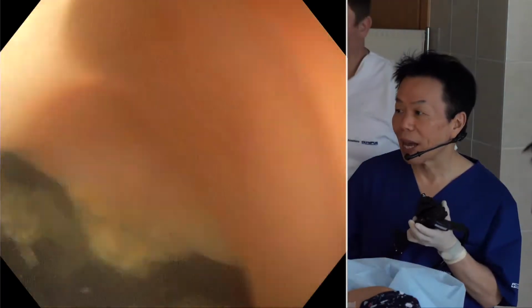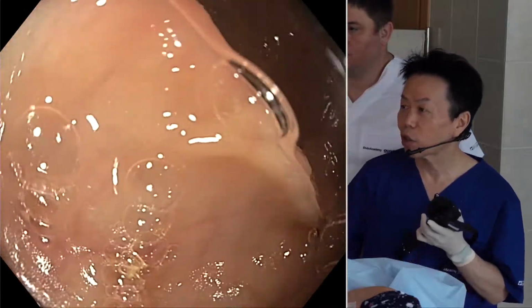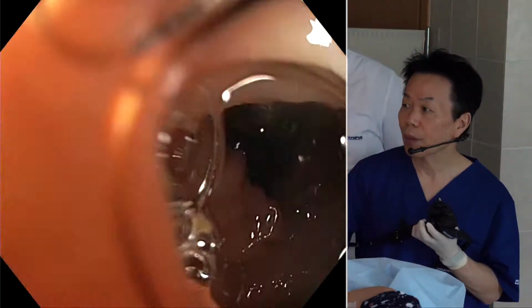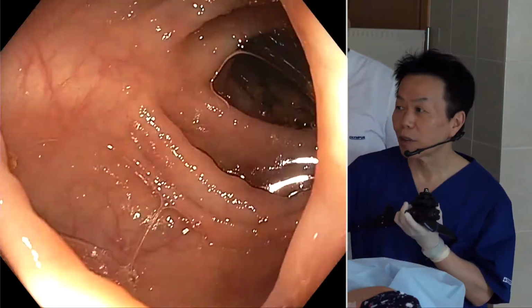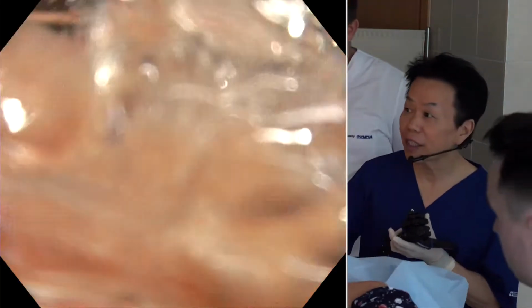So I usually inject only 1/4 of the ampoule. That accounts for 2.5 milligrams or 5 milligrams. I'm not sure, but a small amount is enough. And I usually don't sedate the patient, so I often ask the patient to change position. But today the patient is sedated. Oh, she's coughing. What's the problem?